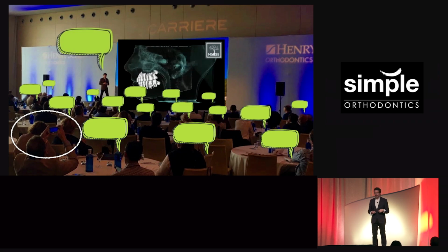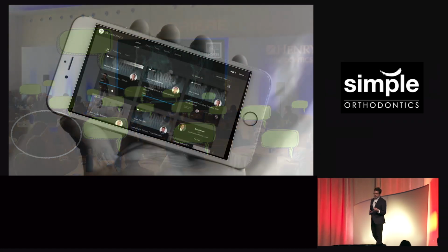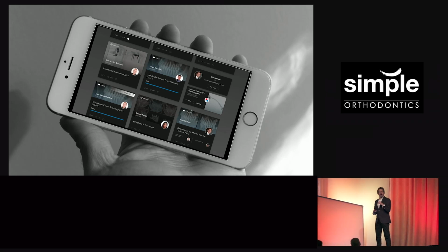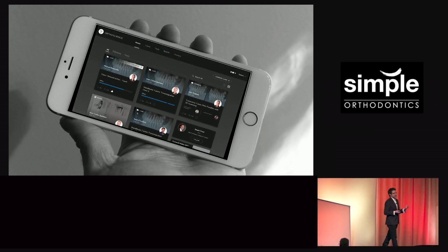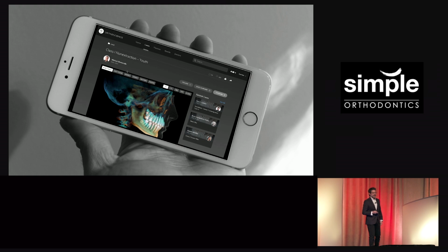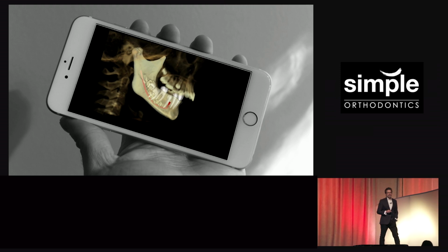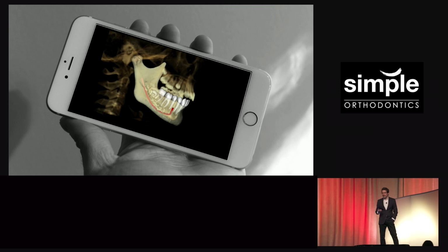Don't take our word for it. Go in and look and make the best decisions for you. It's all coming to your phone. So if there's anything you saw over the last 2 days, in the future, you'll be able to go back to your room or in the elevator ride up and say, I want to look at that case that John showed, because I'm curious to see what did that incisor do? How long did he use that rubber band? What's the wire sequence? Maybe I'll try that.